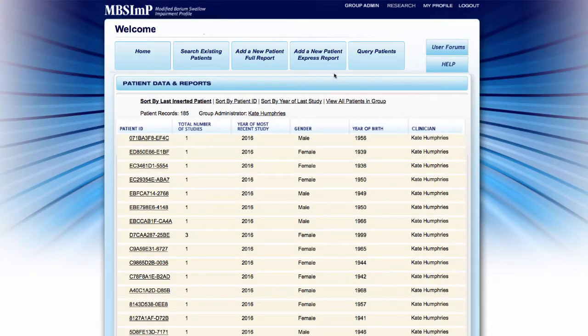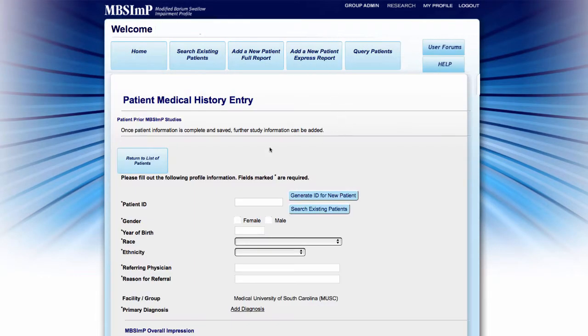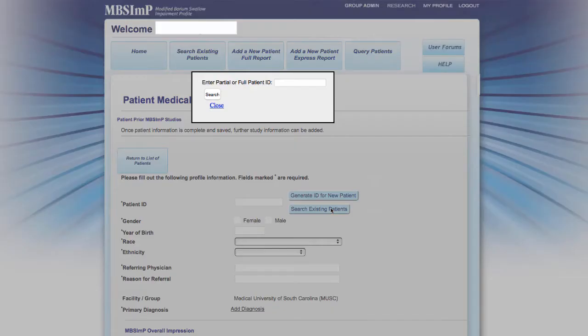When accessed via the Patient Records screen, the Express Report feature provides the option to generate a new patient ID or search for an existing patient ID.